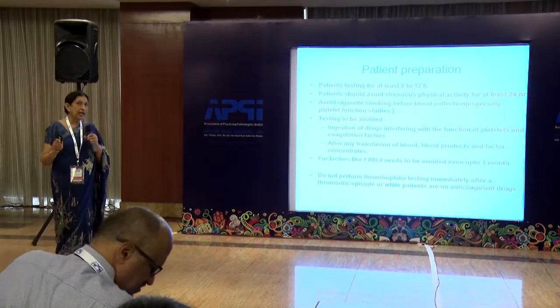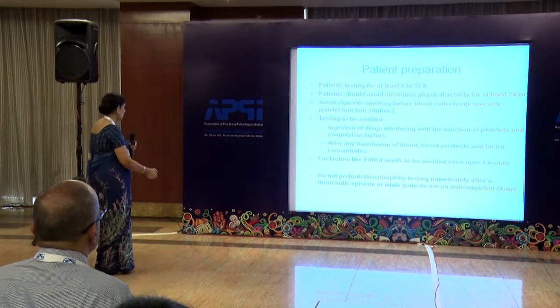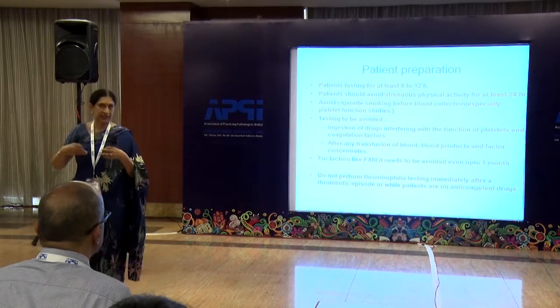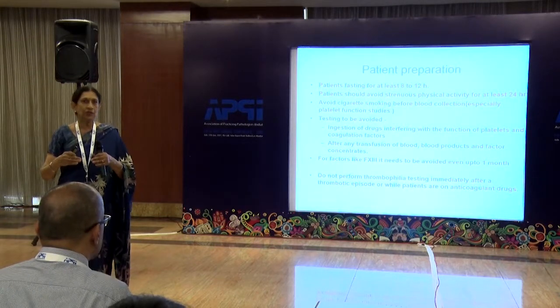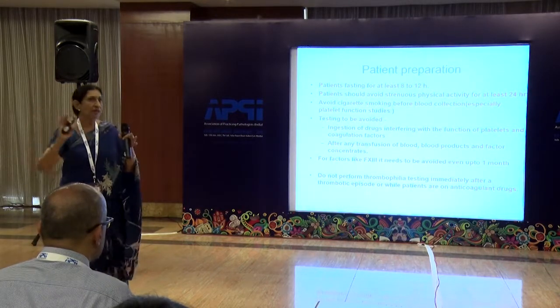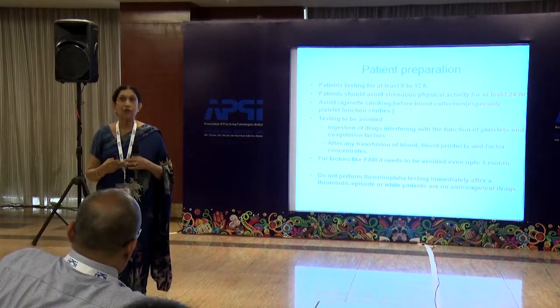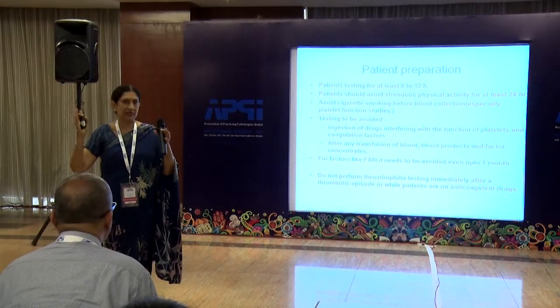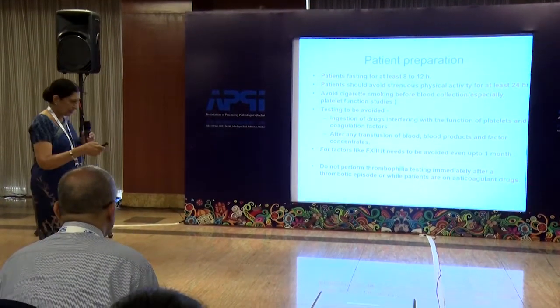And for thrombophilia testing, don't test them immediately after a thrombotic episode, because these patients have already consumed the factors inside the body and they've thrombosed, or they have been put on anticoagulation. So what are you going to test? But the catch is, the clinician says, no, I can't stop anticoagulation in these patients who are clotting inside the body. So what do you do? You advise them not to do clot-based assays. They can do PCRs, they can do all the other tests, but they cannot do clot-based assays.